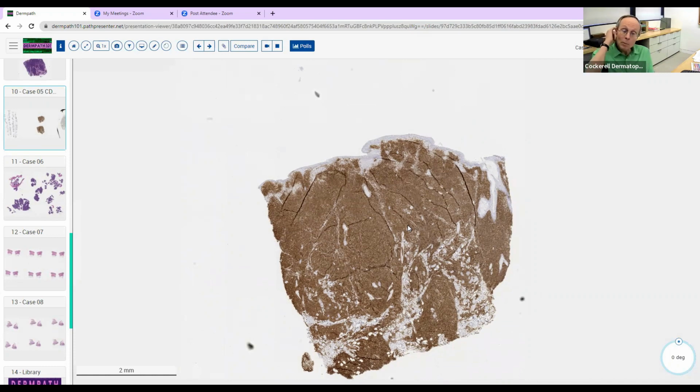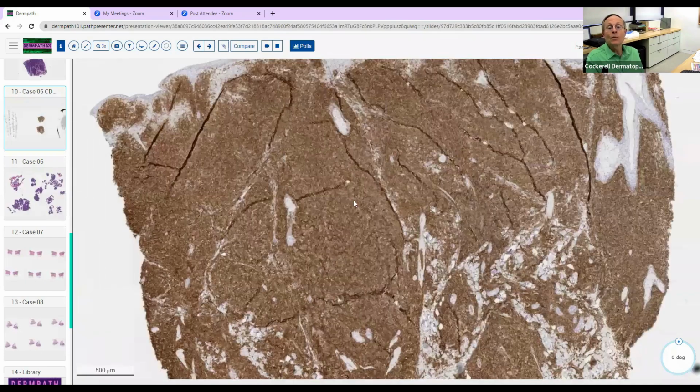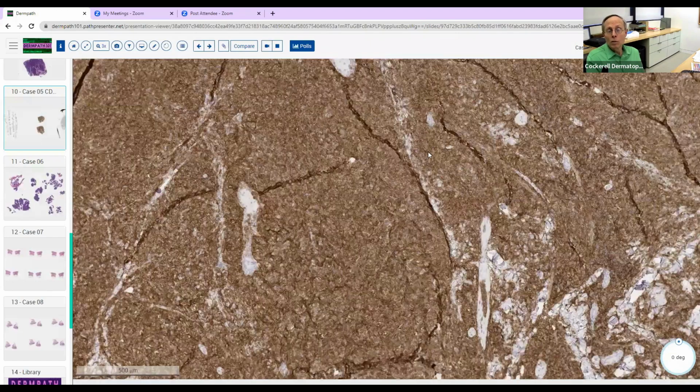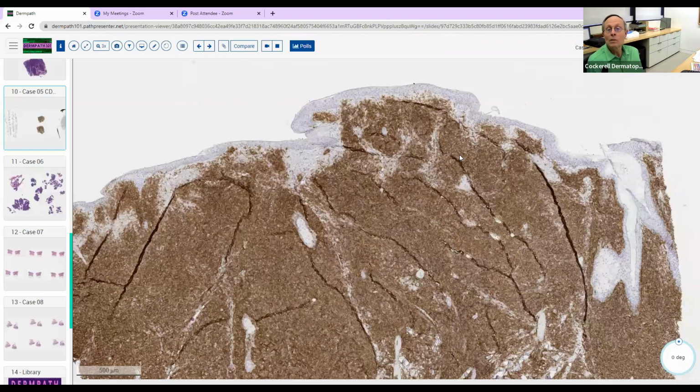And it's not really a lymphoma. It's actually in the family of the hematologic. It's almost more like an AML type of tumor. These cells, and this stain is the CD123 stain, and that's classic for this lesion. And CD123 cells are also seen in inflammatory processes. Also, you've seen in lesions of lupus. You've seen them sometimes in lichen planus. So CD123 marker positive cells, they kind of live in the skin, and they kind of get recruited and become more prominent in certain inflammatory conditions, but not like this.